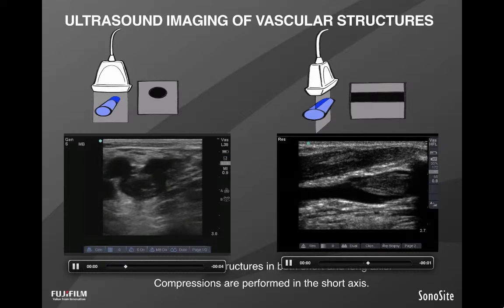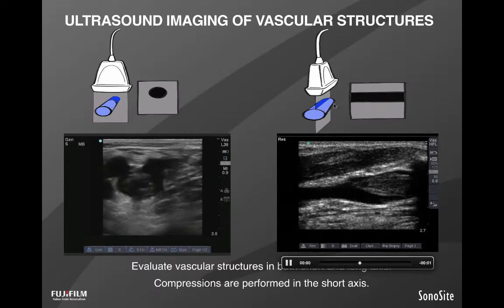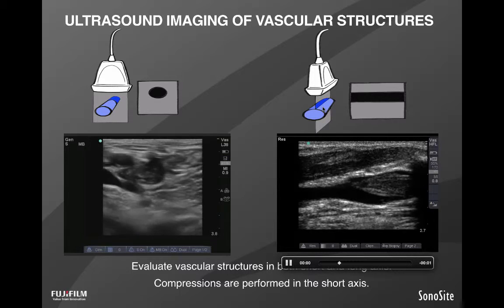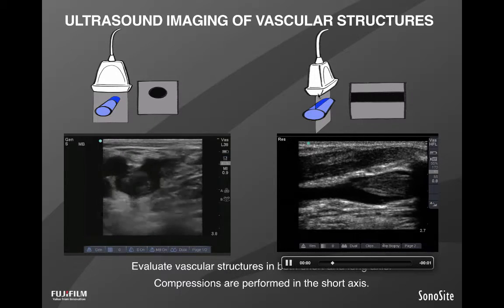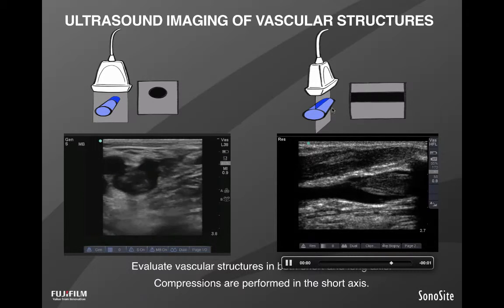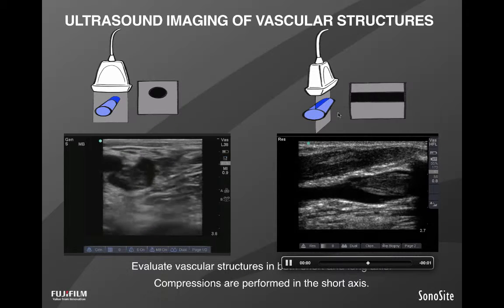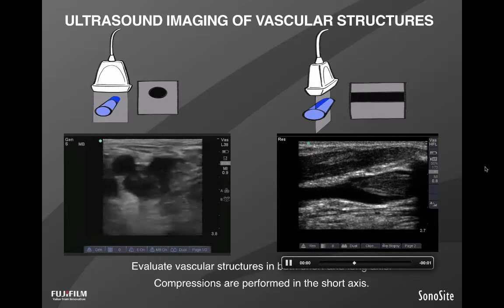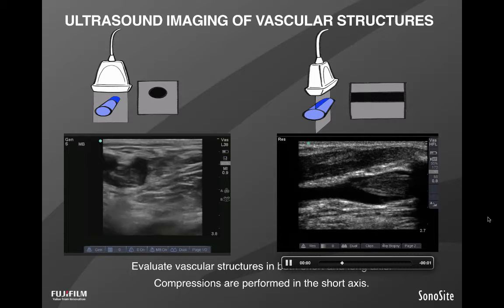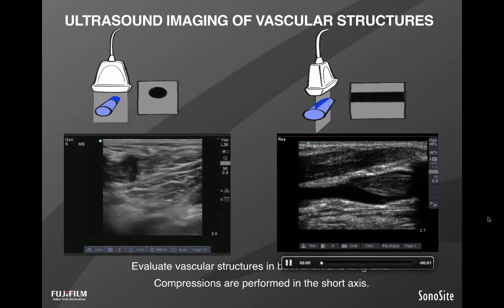but we largely avoid it for diagnosis, largely for reasons because when you're trying to deliver pressure over the vein in longitudinal fashion, sometimes the pressure can be directed next to the vein or you can slip off of the vein, and so sometimes you can mistakenly conclude that something is compressible or not. And so we tend to avoid that. We only do that for, again, gauging the extent of structures.